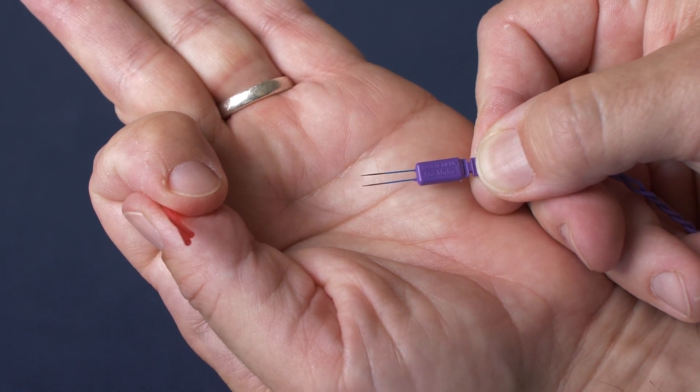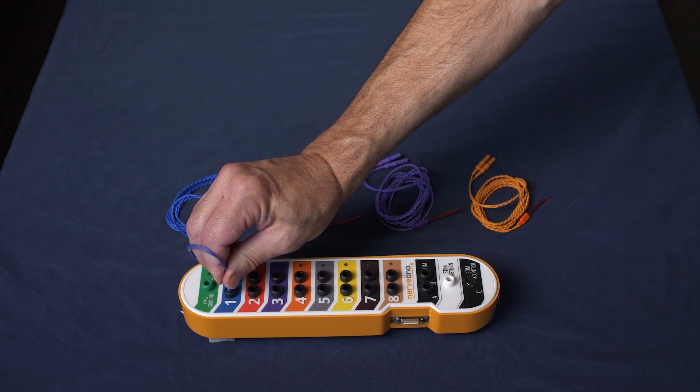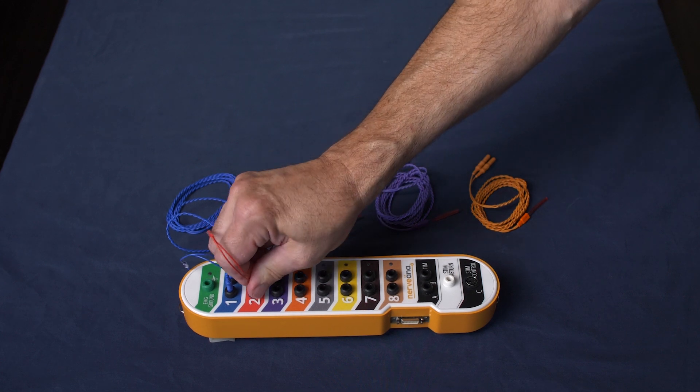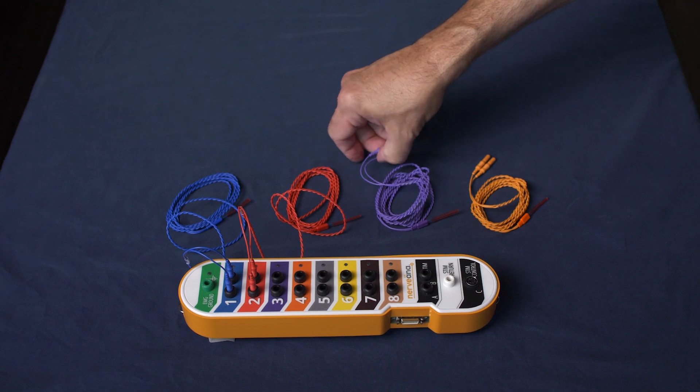Once the needles have been properly situated on the patient, you will connect the Mastodon lead wires to the patient interface for the monitoring system. You can follow the color coding if the system provides that. If not, the technician will direct you as to which channel number to place the colors so that they can follow the montage properly.